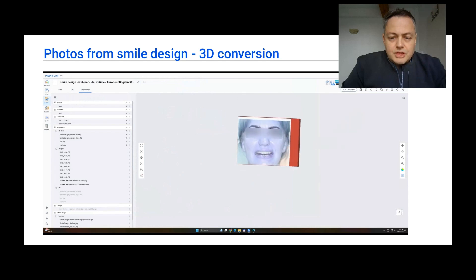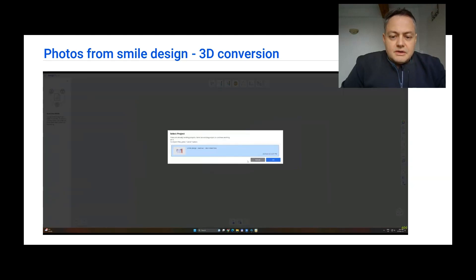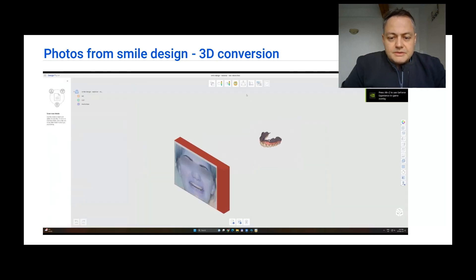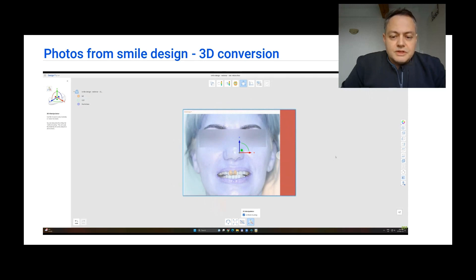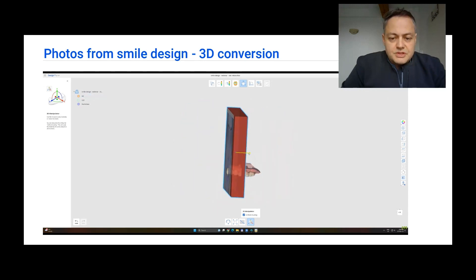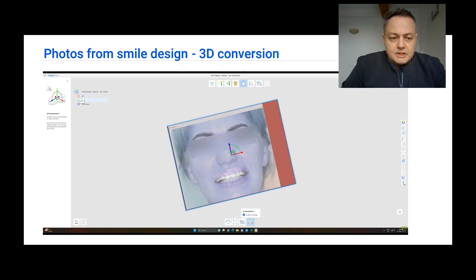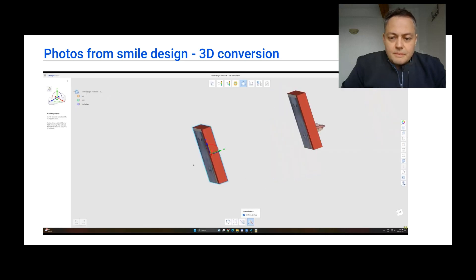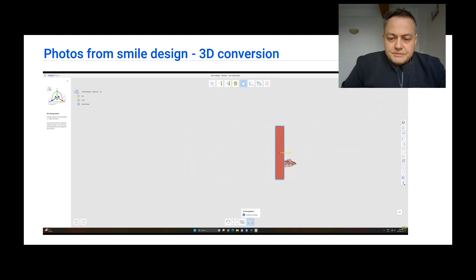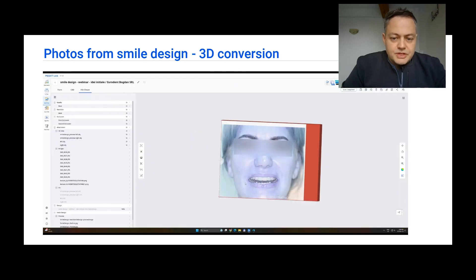As you can see here, we did not check the position in all axes, so we are going to get back to the design. With the help of the manipulator tool, we are going to pull back the photo until it just intersects a little bit of the front teeth. Now that the first photo is positioned, we can still manipulate it a little bit. Then we are going to get the second one to realign with the first. Now that everything is done, we are going to export these objects — because they are now three-dimensional objects — to MeditLink, to be used at a later date.